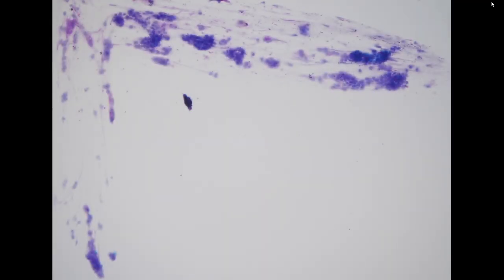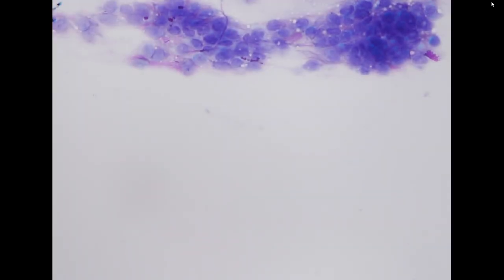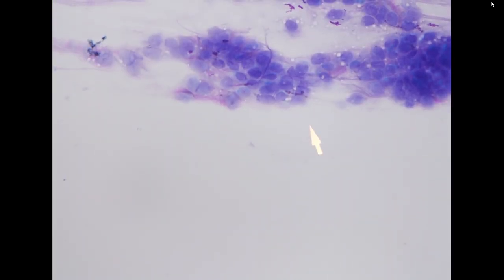In this direct smear, the cellularity is very low. We only have a few clusters, but we can definitely appreciate these uniform mononuclear cells in association with this fibrillary extracellular material.